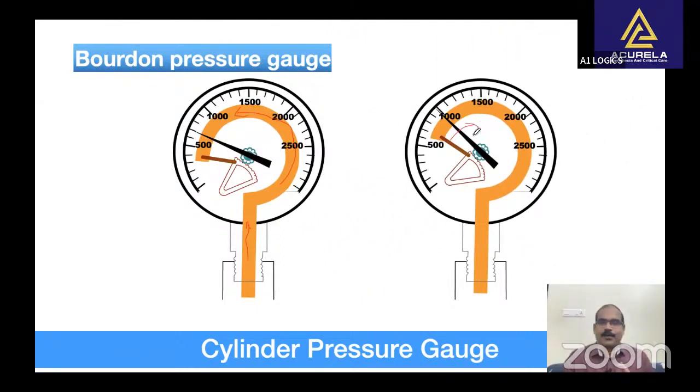As the pressure falls, the tube resumes its curved shape. Because the open end is fixed, the sealed end moves. These motions are transmitted to the indicator, which moves over a calibrated scale. The gauges are required to be calibrated in kilopascals, but pounds per square inch (psi) may also be used.